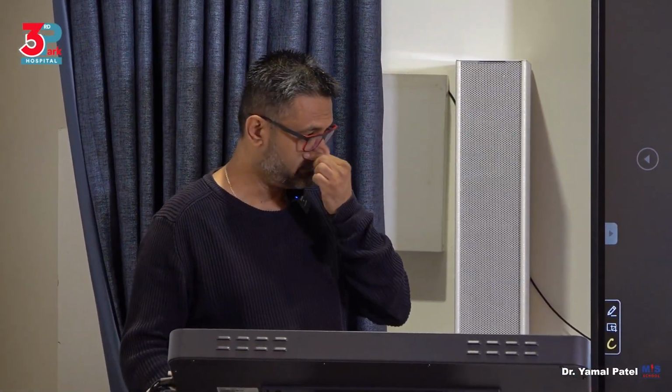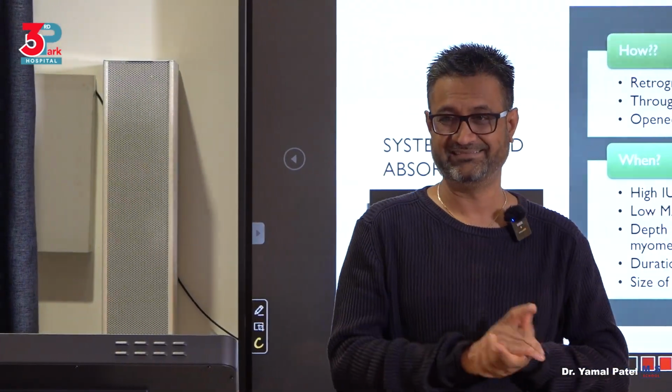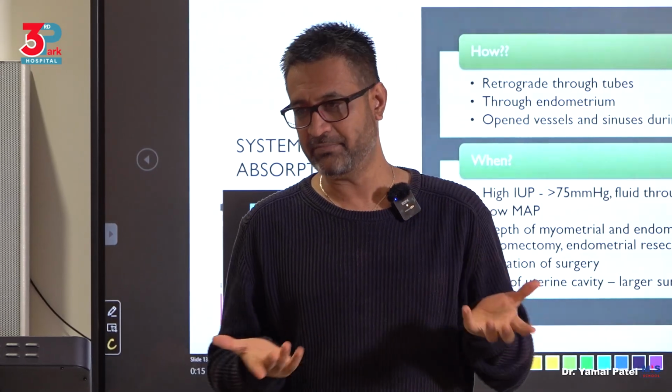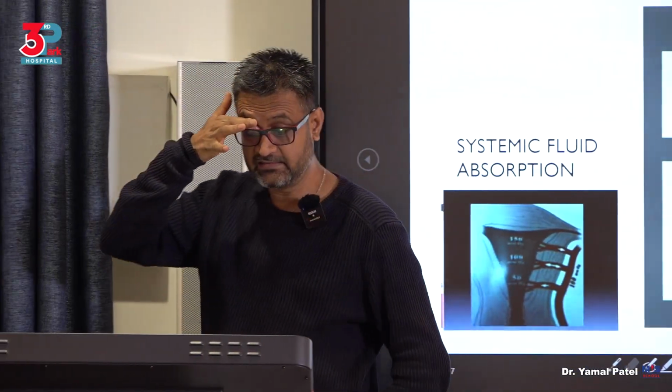So what is our problem with this fluid distending media? We are worried about mainly the absorption, isn't it? That's the main issue. We're worried about absorption. And how is this fluid absorbed? It can be absorbed retrograde into the abdominal cavity through the tubes.